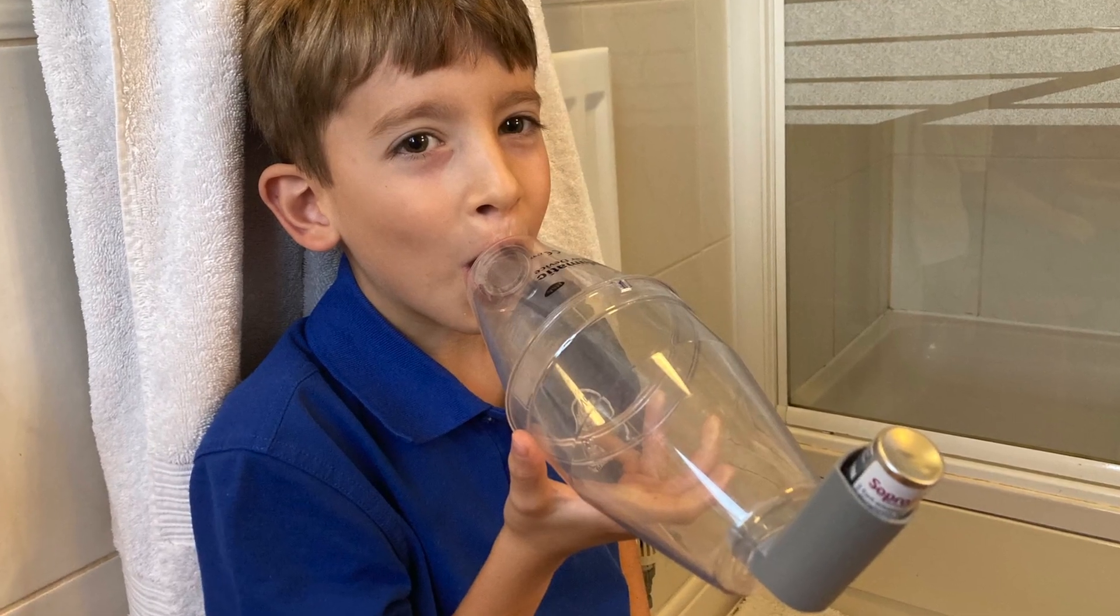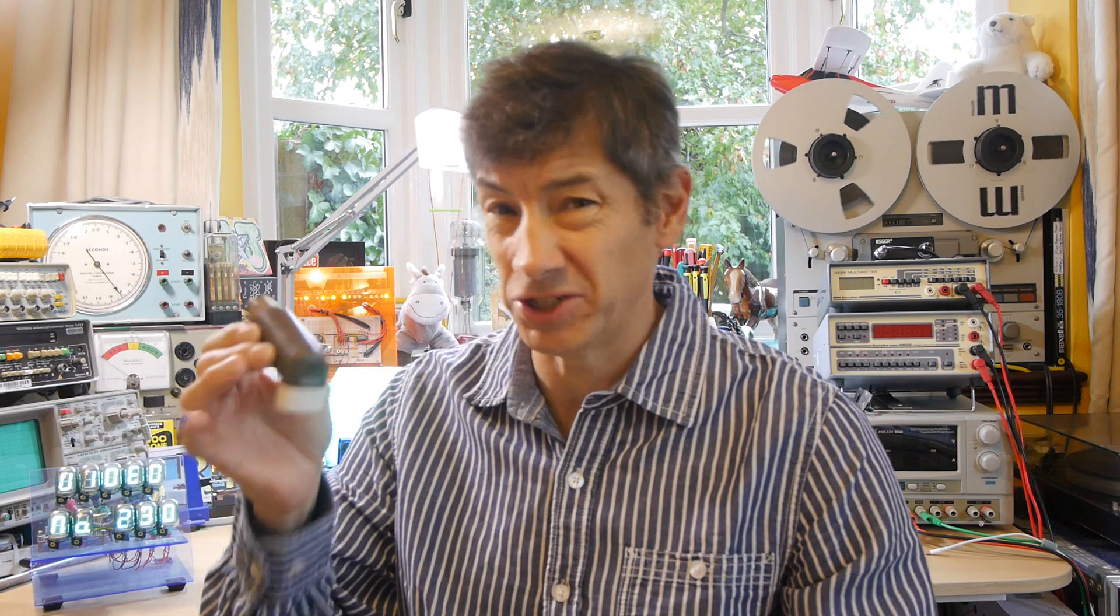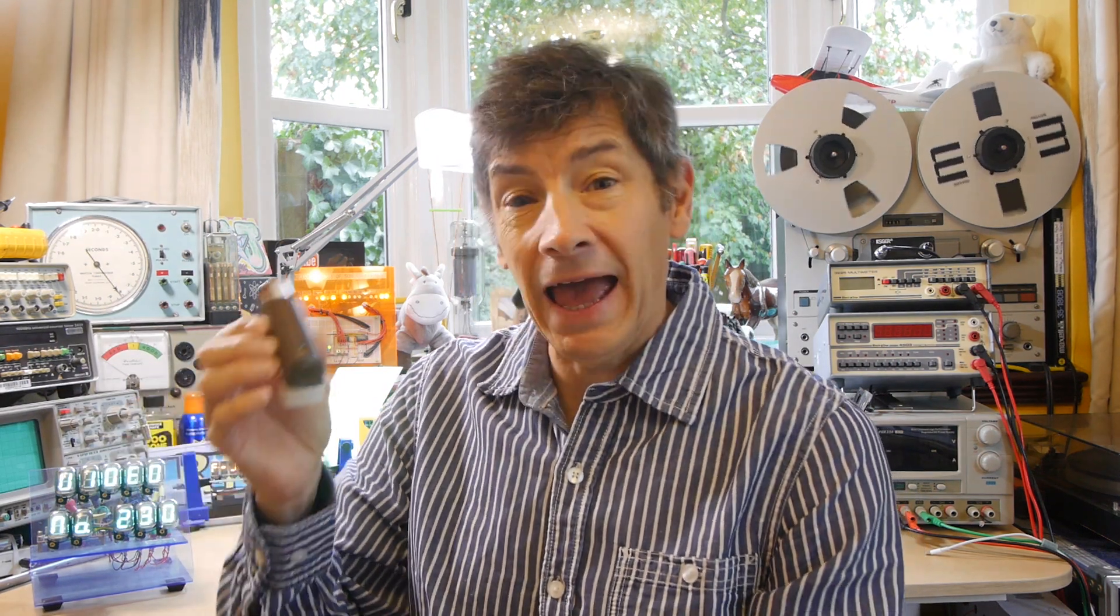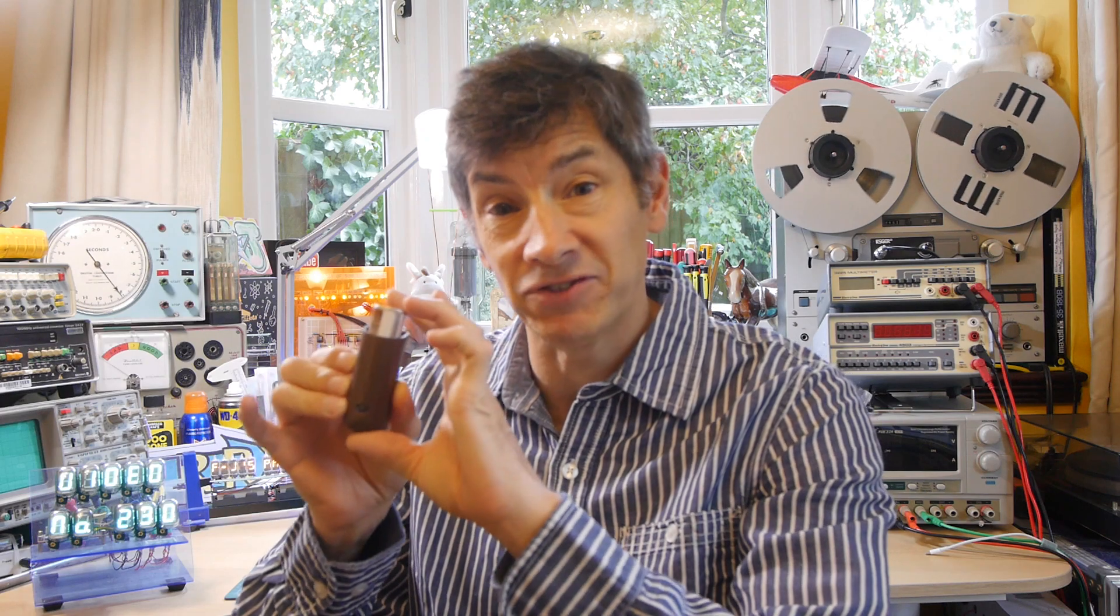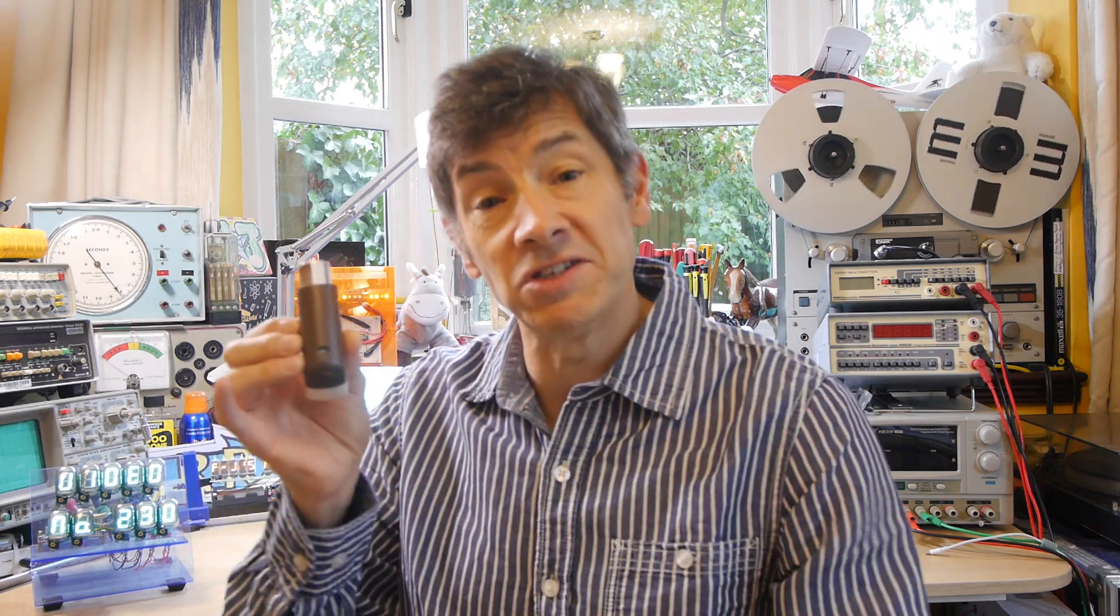Whilst we're not sure whether Barry actually has asthma he's been on one of these brown inhalers for quite a while that prevents him getting the symptoms. It's a really interesting device because on the back of it there's a little counter that tells you how many puffs you've had and it stops at zero when it thinks the container is empty.